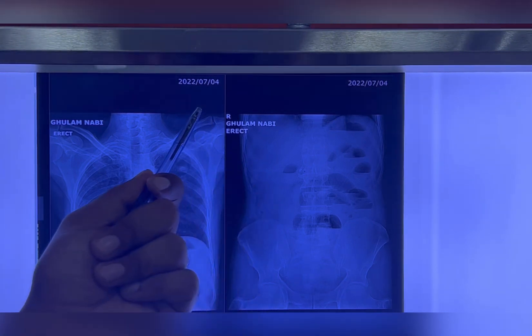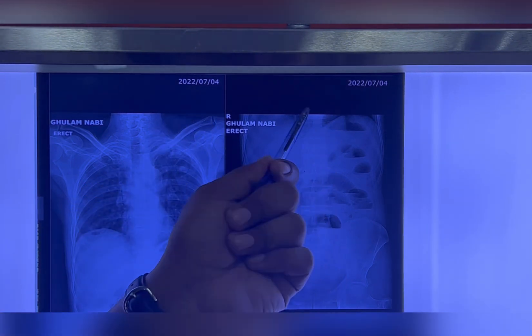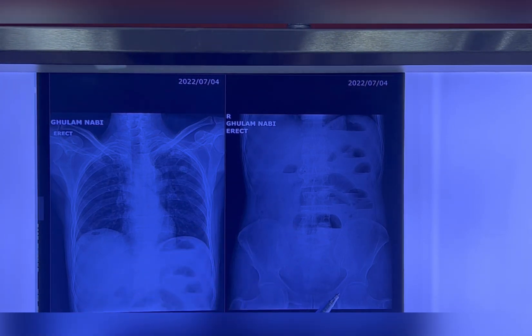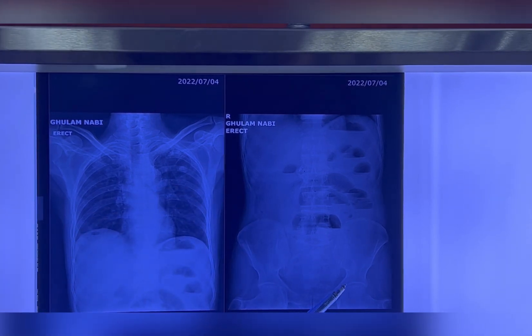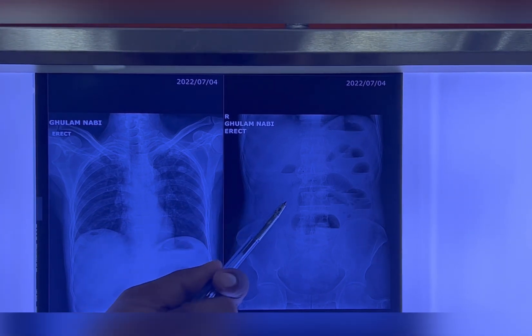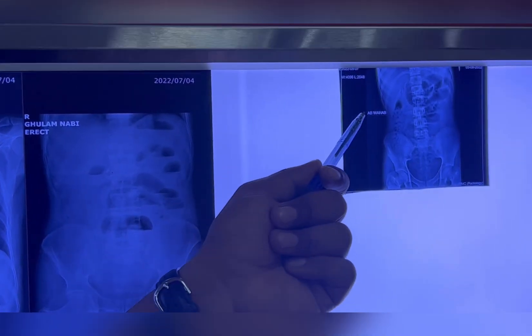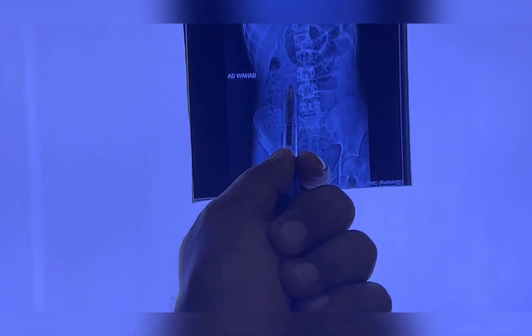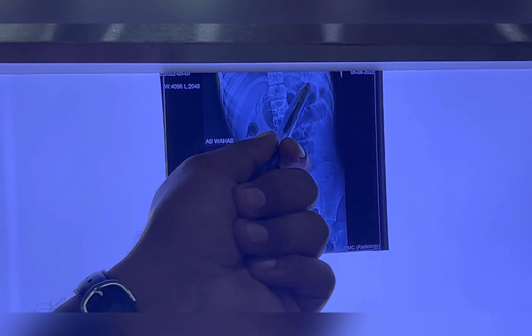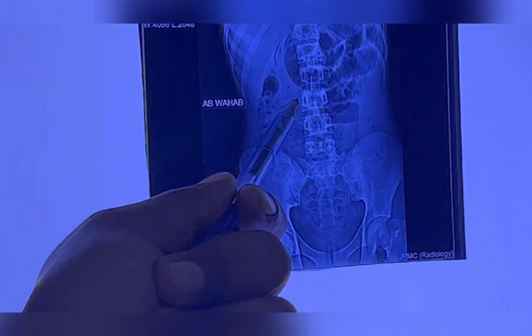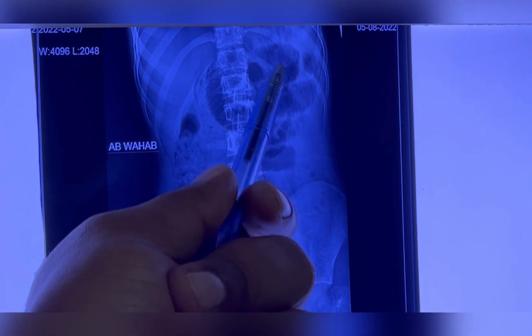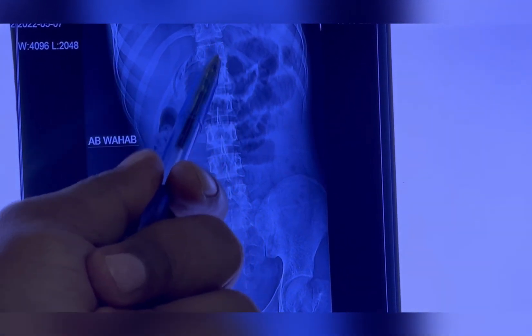After knowing that there is obstruction, it is very important to determine the level of obstruction. For the level of obstruction, we should go for the X-ray abdomen supine. In the supine X-ray, you will not see any air fluid levels — only the loops of gut are visible. We then have to decide whether these loops are ileum, jejunum, colon, or stomach.